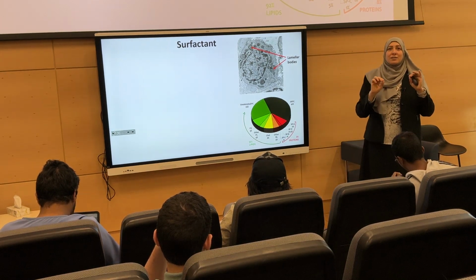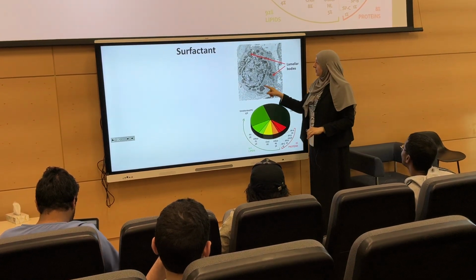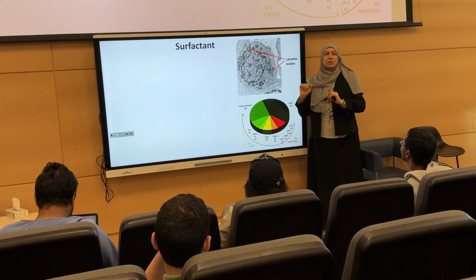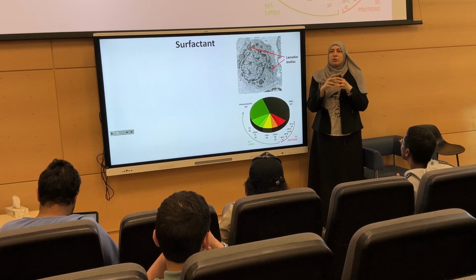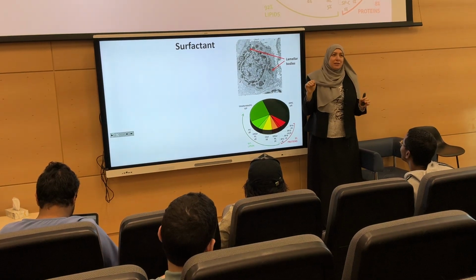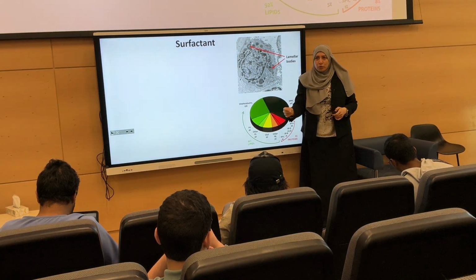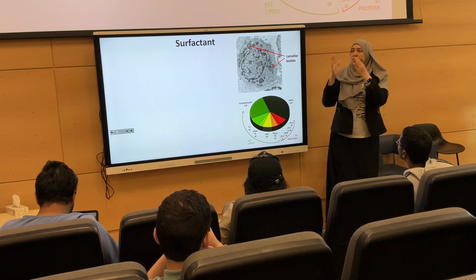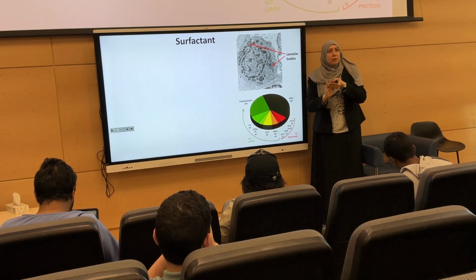Histologically, the surfactant has a very unique structure that we can see by electron microscope. Can you see this? What are these structures? No, they are not lines. This is a vesicle that stores the lipoprotein. When the lipoprotein starts to accumulate and is stored in the cell, it's not just arranged haphazardly. They make layers. We name it lamellae. So this is called a lamellar body. And once I see this, immediately I know that this is surfactant. So which organ is this? Lung, immediately. Don't think; once you see this, you don't have this view in any other cell. So once you see the lamellar bodies, this is lung.